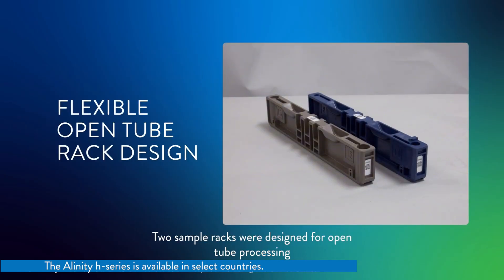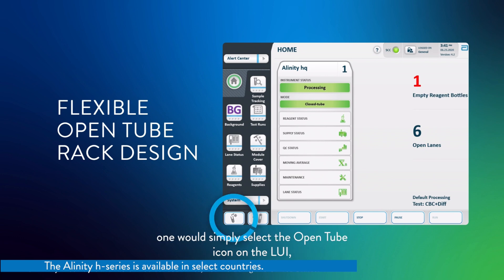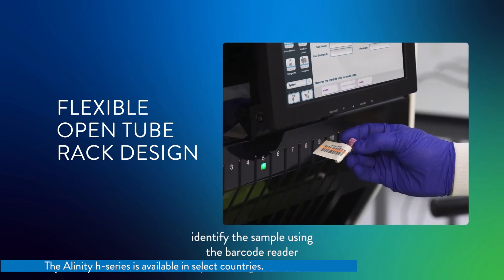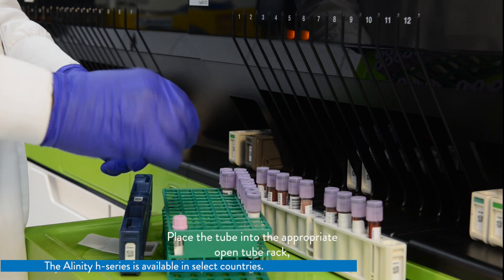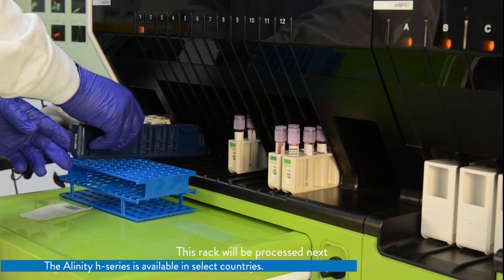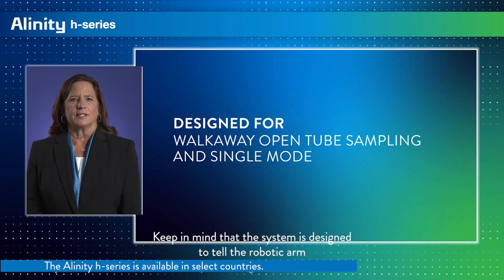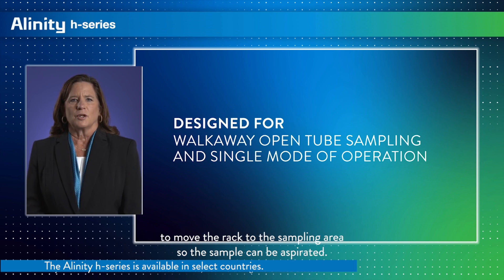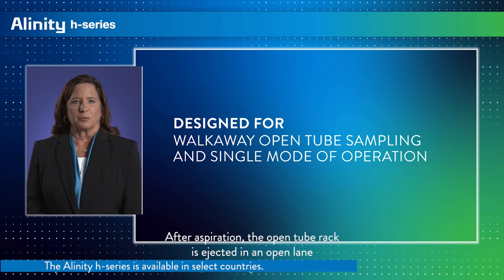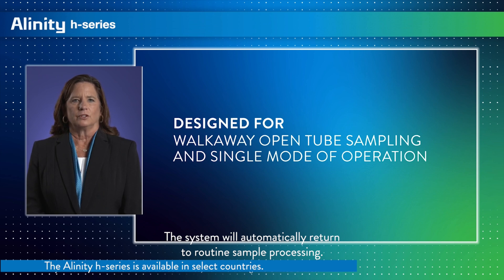Two sample racks were designed for open tube processing to hold sample tubes of various sizes. To process open tube samples, one would simply select the open tube icon on the LUI, identify the sample using the barcode reader, confirm the tube is well mixed, place the tube into the appropriate open tube rack, then insert the open tube rack into any available lane. This rack will be processed next because the system will know it was manually mixed. The system is designed to tell the robotic arm to move the rack to the sampling area so the sample can be aspirated. After aspiration, the open tube rack is ejected in an open lane in the loading area, allowing the user to remove the rack. The system will then automatically return to routine sample processing.